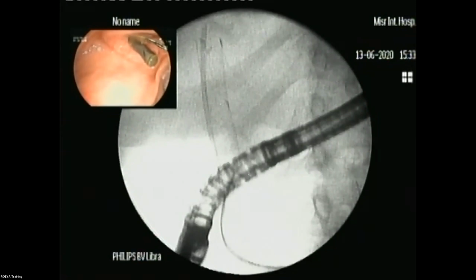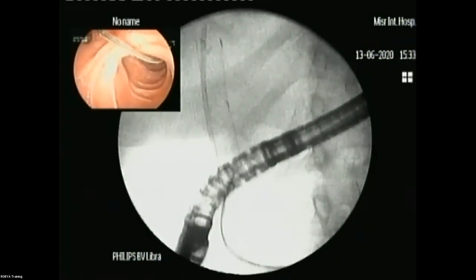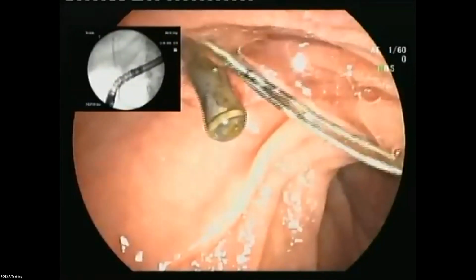Hani, can you give me a large picture of the video? Next room, could we have a bigger endoscopic view? Yes, very good.